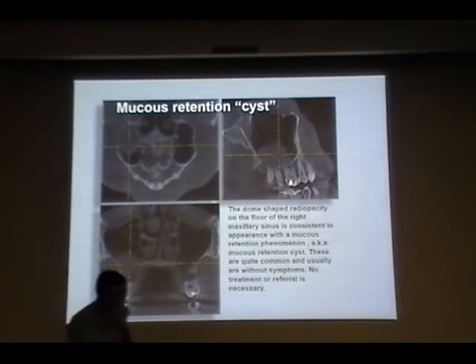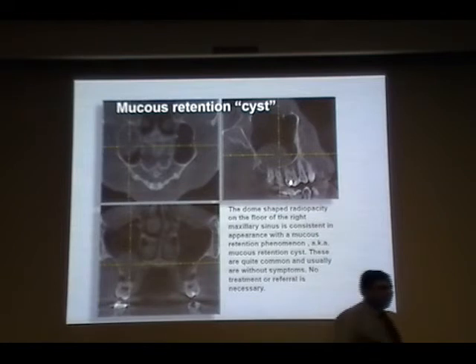So you got three different things, just looking at the maxillary sinus. One is a sinus problem, then you are going to refer. If there is a corticated border, a white line, you are going to treat. Here, it's neither of our problem, neither ENT's problem nor dentist's problem. But you should be able to recognize what this is.